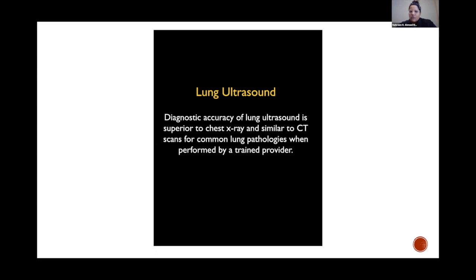Point-of-care ultrasound, to take a step back, I think many of you are emergency physicians, so you are actually the pioneers of point-of-care ultrasound. And for me, being in pulmonary and critical care, over the last decade point-of-care has become a part of our toolbox and is now becoming standard of care. As far as lung ultrasound itself, its diagnostic accuracy is actually superior to chest x-ray and very similar to CT scans for common lung pathologies, especially for trained providers. It is one of the most easily teachable ultrasound exams, although it has a lot of nuances, but I hope I can cover some of the basics here for you.